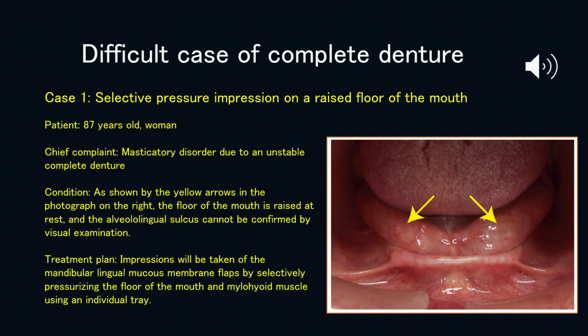Condition. As shown by the yellow arrows in the photograph on the right, the floor of the mouth is raised at rest, and the alveololingual sulcus cannot be confirmed by visual examination.